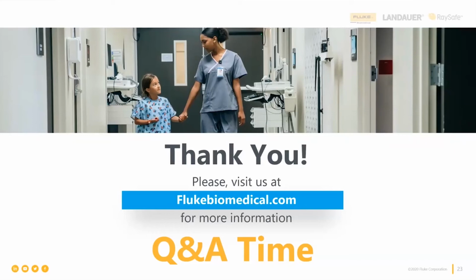further impedance sensing circuit, impedance sensing functionality and automatic adjustment functionality assessment of the defibrillator, then you need this 7010 external load accessory. Or if you're not using a Fluke Biomedical defibrillator analyzer, you need the external load accessory from the manufacturer of your defibrillator analyzer.